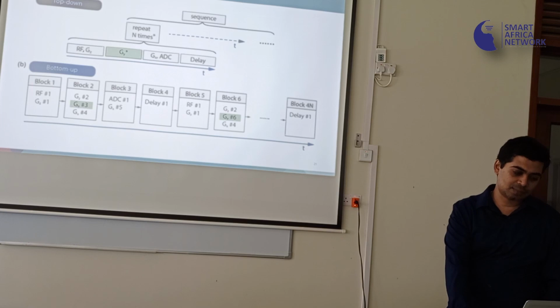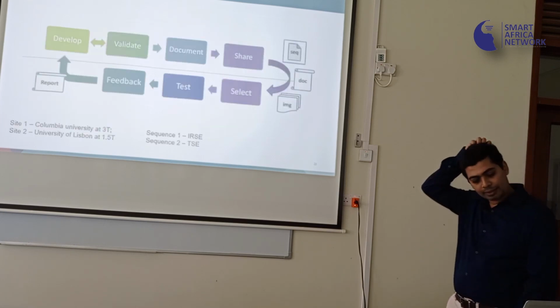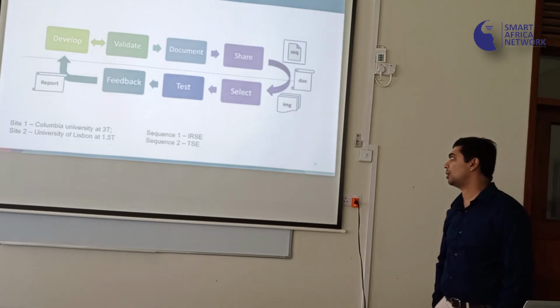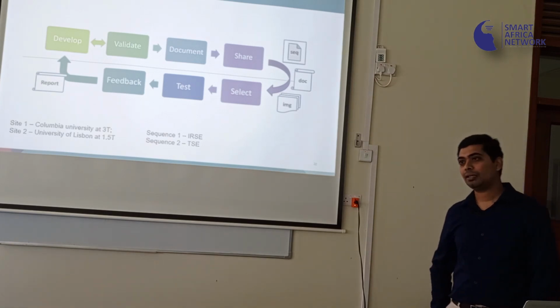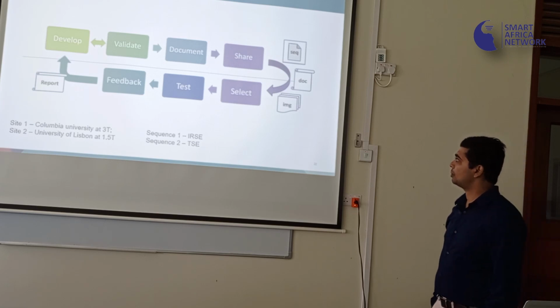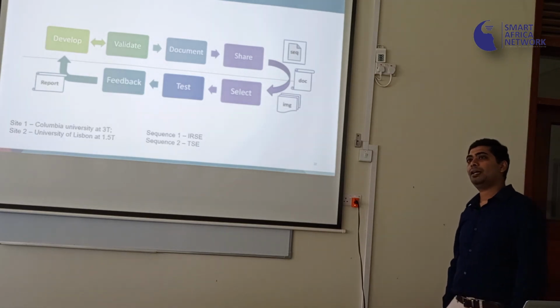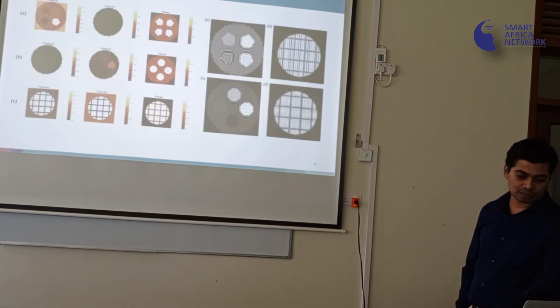I'll skip this one. This is mostly about how we go about doing that. Here's how it works right now. We did some sequences at our University of Columbia on a 3 Tesla and then shipped it off to Lisbon on another continent for 1.5 Tesla. We tried 2 different kinds of sequences where we developed, we let them use it, gave us some feedback, and then we're trying to figure out whether you can play the same sequence or not.